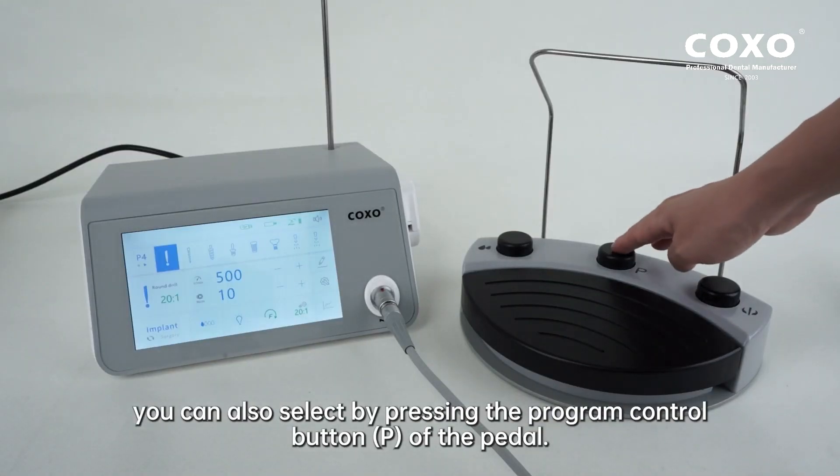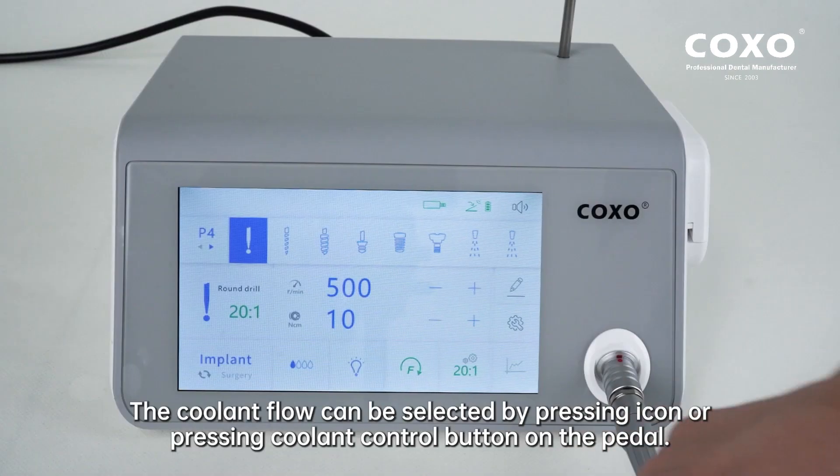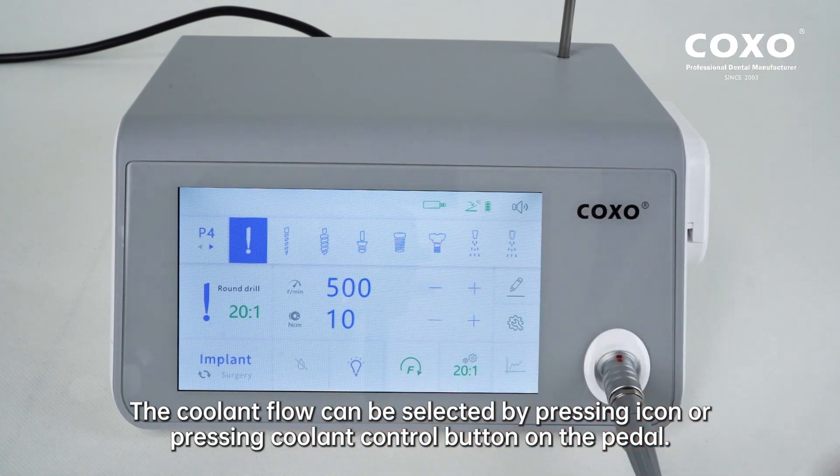You can also select by pressing the program control button P of the pedal. The coolant flow can be selected by pressing the icon or pressing the coolant control button on the pedal.